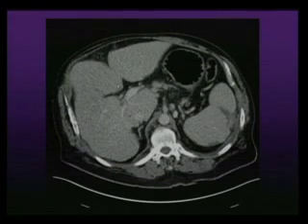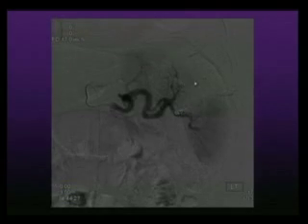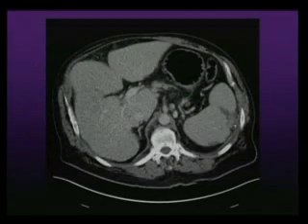This is a CT scan. It shows you that he has some sort of cirrhosis here. Initially we had embolized the spleen, remember? This is how it looks, like a scar. Over a period, the spleen regenerates. Like the liver regenerates, the spleen regenerates. So we had embolized him. See this? We embolized a decent part of it here, right? But on his next scan, it has regrown. So only a little part is embolized.